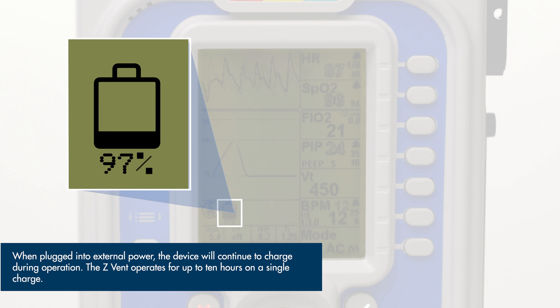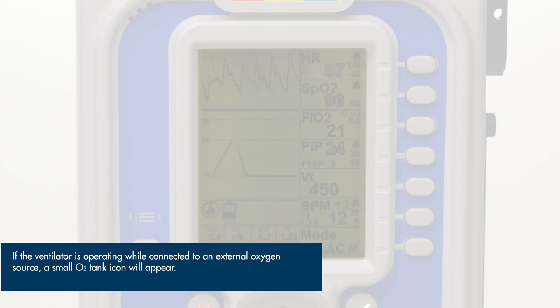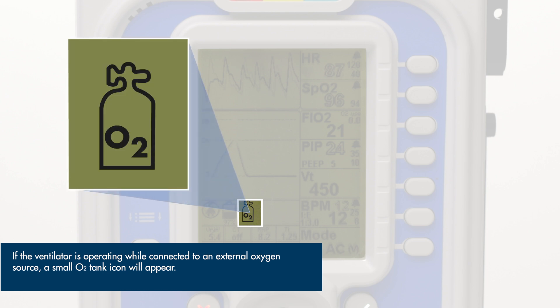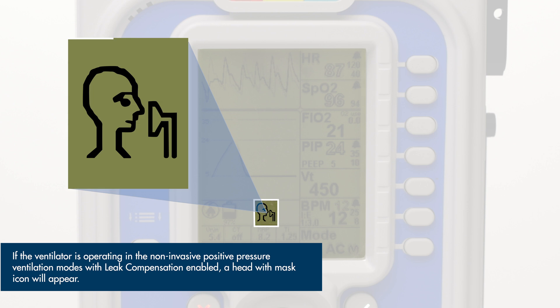The Z-VENT operates for up to 10 hours on a single charge. If the ventilator is operating while connected to an external oxygen source, a small O2 tank icon will appear. If the ventilator is operating in the non-invasive positive pressure ventilation modes with leak compensation enabled, a head with mask icon will appear.